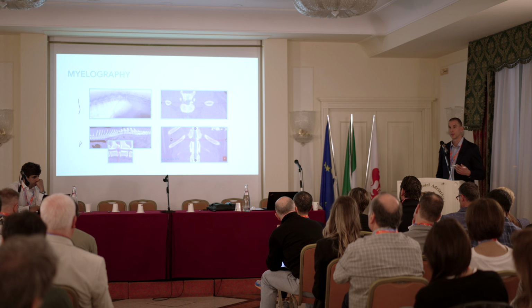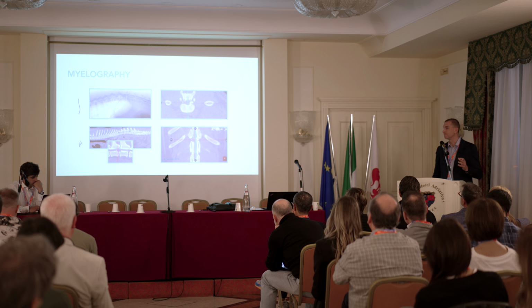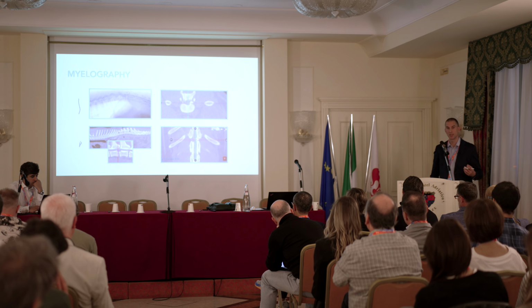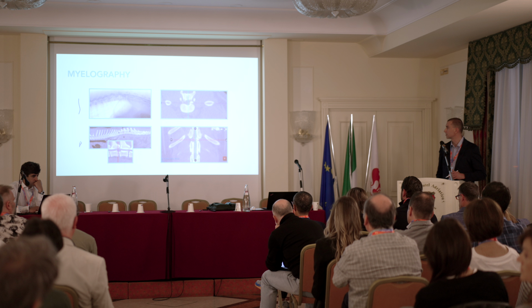So the fluoro in this case is something just for quick orientation about the problem, but it's not perfect diagnostic tool for tiny intervertebral masses or disc protrusion, extrusion or something like that.